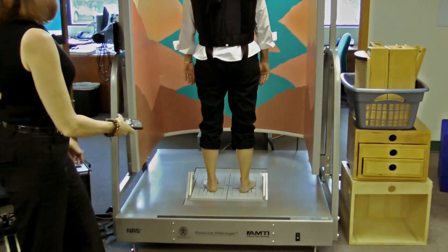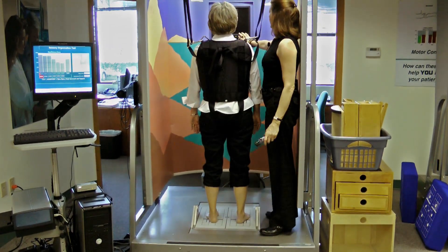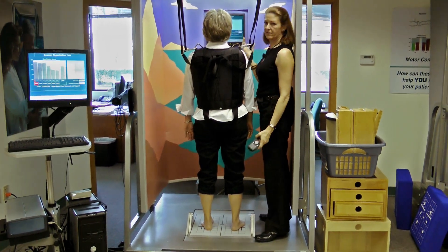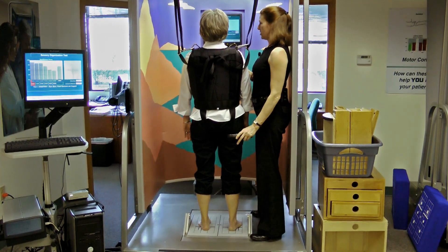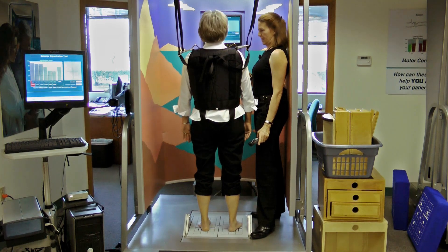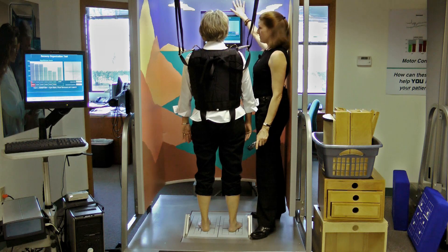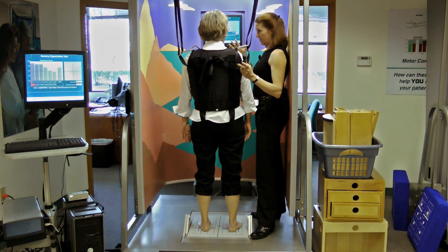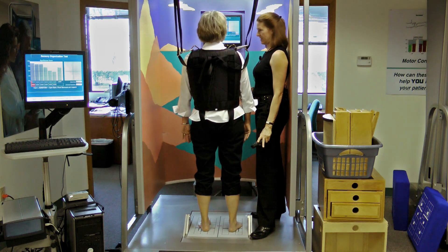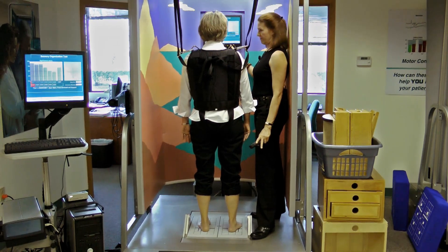Mary, we're going to be performing a test that has six conditions. You're going to have six conditions in this system and get three little tests of each condition. Sometimes I'll have your eyes open, sometimes I'll have you close your eyes. On some of the conditions the walls are going to move, and on some of the conditions the floor is going to move. I'm going to tell you what's going to happen every step of the way, but you don't get any feedback from this.